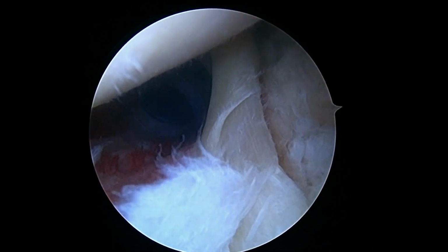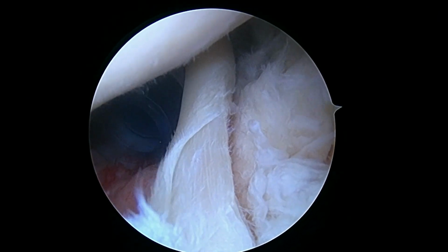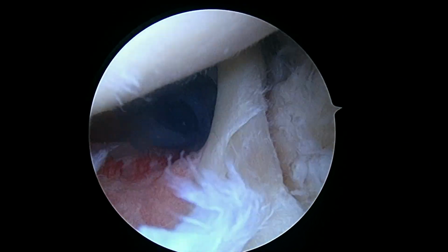Hi, it's Dr. Buford. We're just getting started on your left shoulder. We're looking in from the back to the front. Everything you see is magnified about 40 times on the screen. The first thing that you can see is this biceps, and you can see how frayed your biceps tendon is.